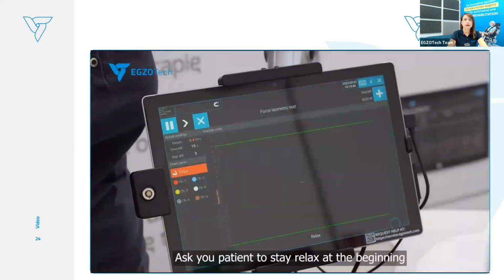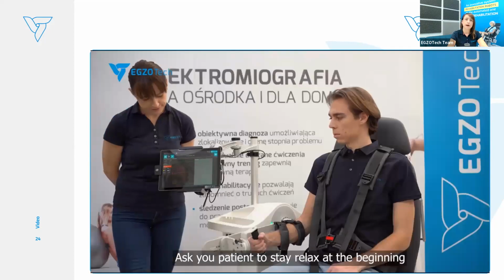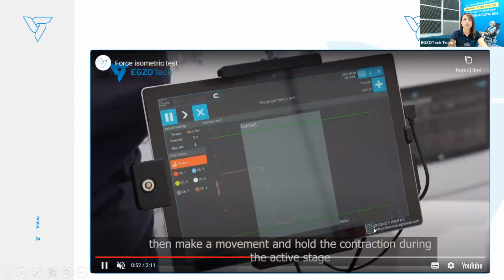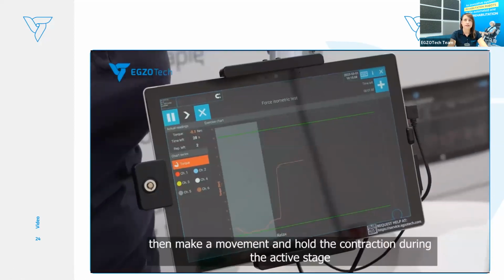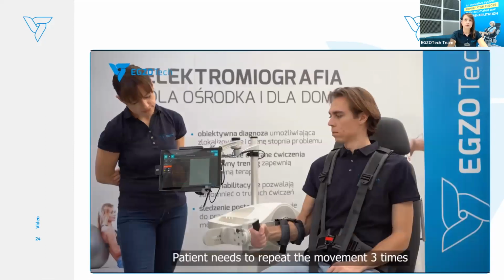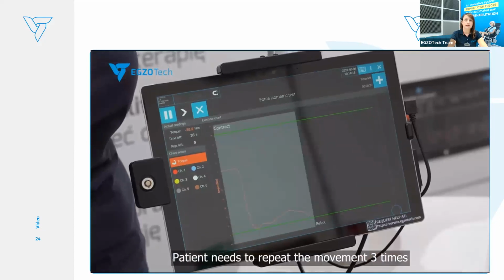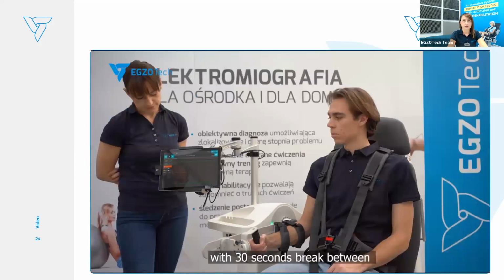And the Luna will position the upper limb, in this case the elbow, at 90 degrees. So automatically it will go to 90 degrees. And in the lower limb, it will go more to the neutral position of the lower limb, also to perform this kind of test, in both directions, flexion and extension.